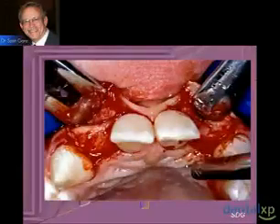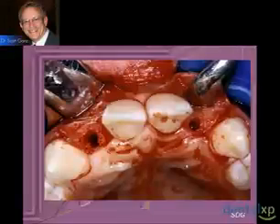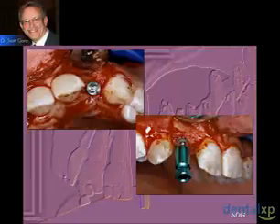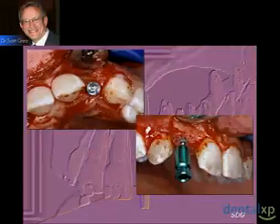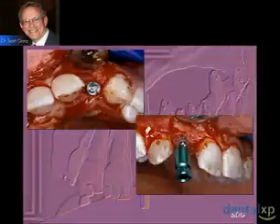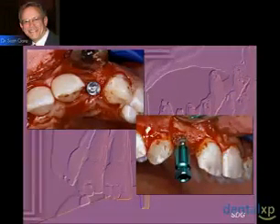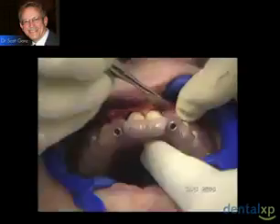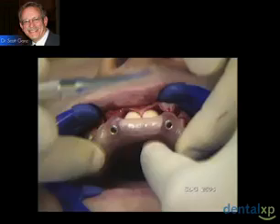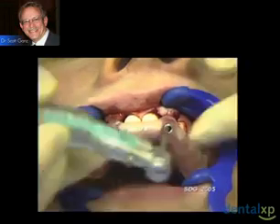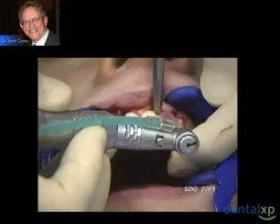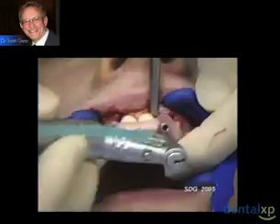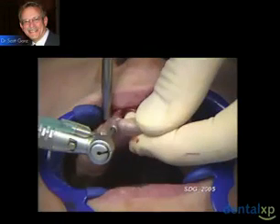As the implants are going in, we can start to pay attention to that anti-rotational feature — in this case the internal connection. This implant is not fully seated yet, but we can evaluate where the flat of the hex will reside. We can see the actual surgical intervention in a quick video: the site is exposed, and we go in utilizing sequential drilling. Looking at the technology in terms of planning, we can appreciate that we can see the anti-rotational feature in the virtual part of this program.